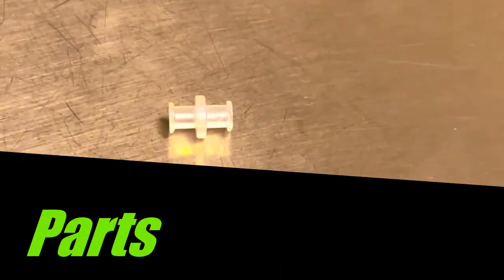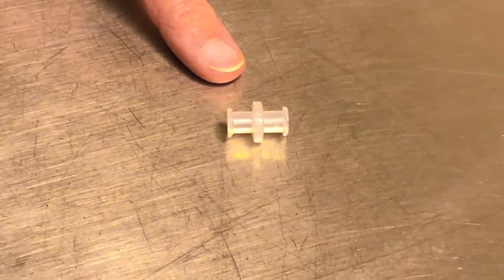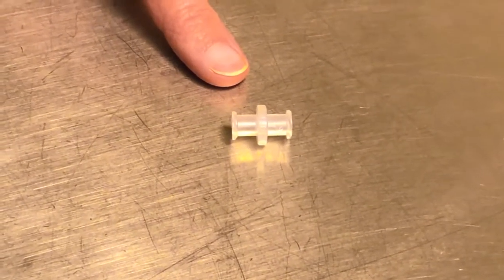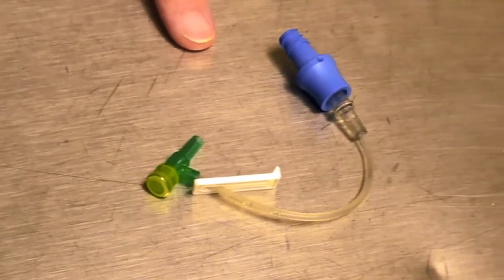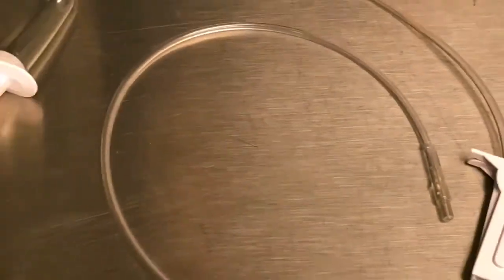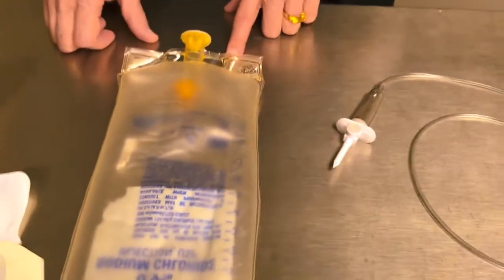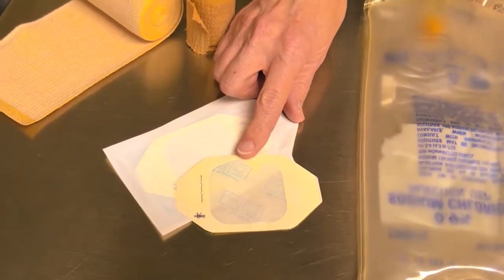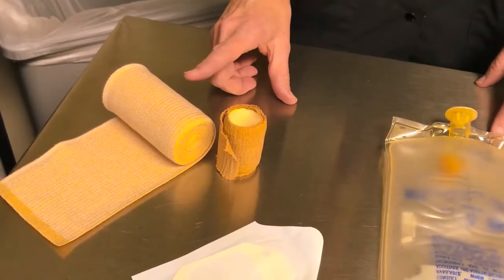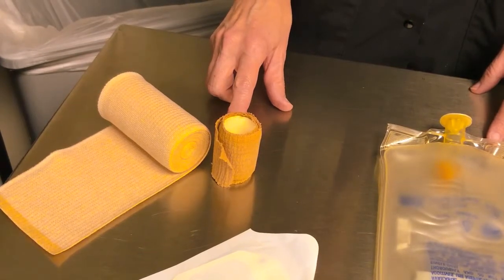The simulated IV bypass system uses just a few parts, and most of them you already have in your labs. The one part you probably don't have and is necessary for the construction of the apparatus is this female to female luer connector. You're also going to need an IV extension set, some type of drainage tubing that allows backflow of fluids. We use IV secondary tubing, a bag for collection of the fluids, so we just use an empty 1 liter IV bag, your occlusive IV site dressing, and then you may want some type of compression bandage to use to secure the drainage tubing to the mannequin's arm, as well as obscure it from the student's vision.